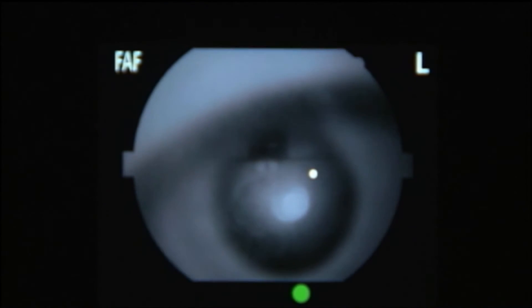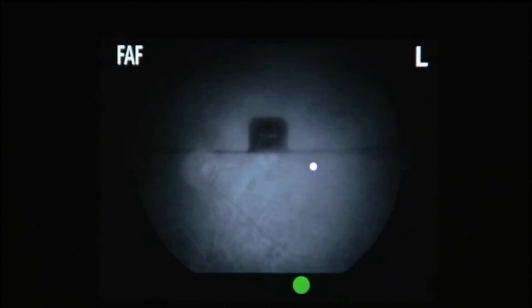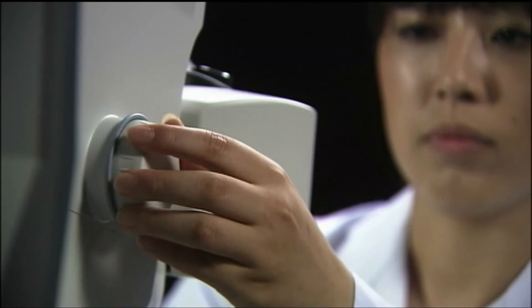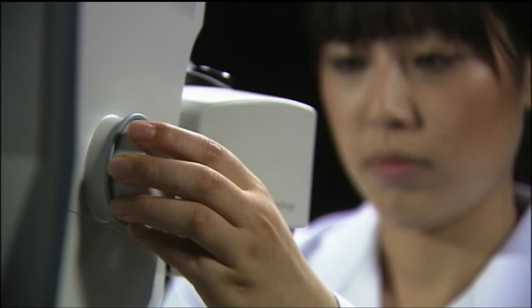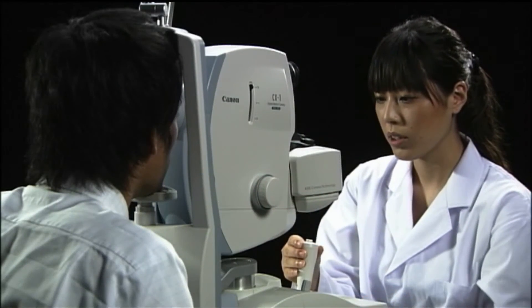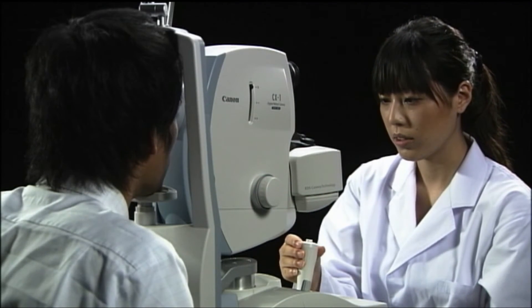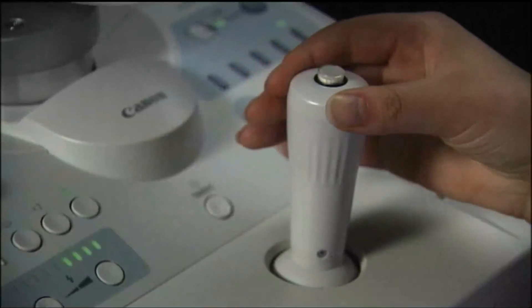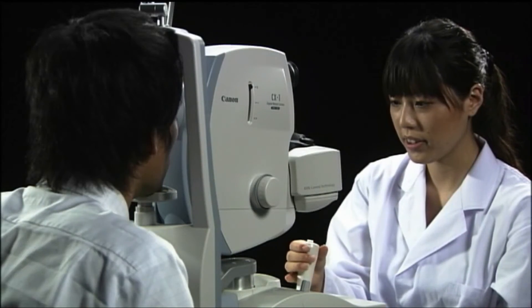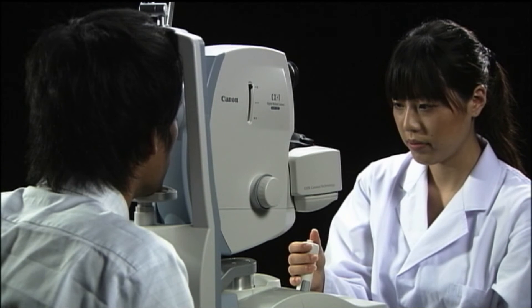Check the positioning for the retinal image. Adjust the focus. And finally, perform the fine adjustments and capture the image.